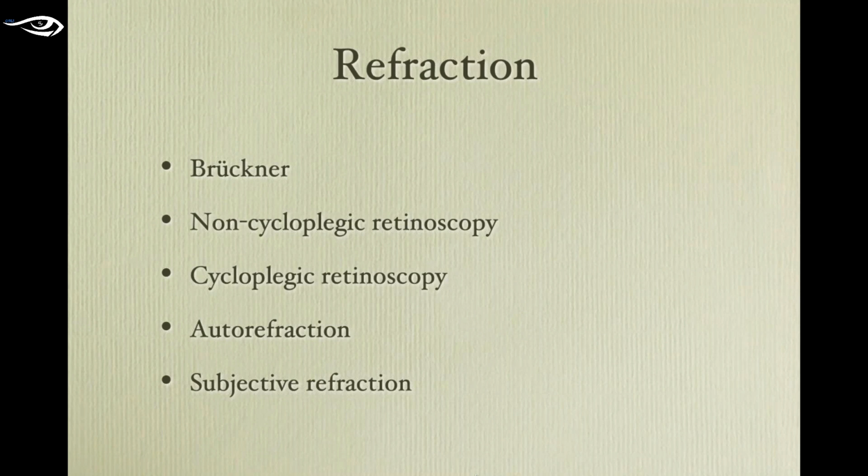So I do both dry refraction, then wet refraction, and then I base what I'm going to do on that. Autorefraction in young kids, in my view, is a screening technique. It's useful as a screening technique. I don't see any use for it as a diagnostic technique. Lots of people use it, they recommend it. I don't think so. Subjective refraction in a young child is not going to happen. In a special needs kid, it's not going to happen. So obviously, you can do subjective refraction when you can, but it's certainly not something you're going to be dependent on.